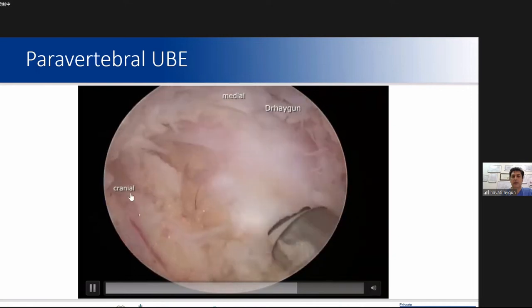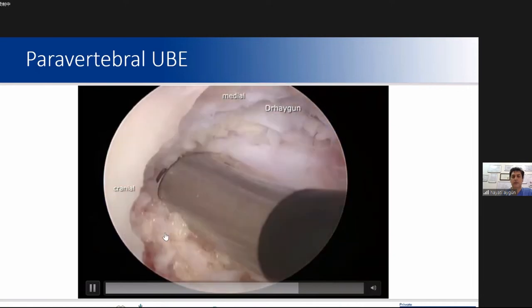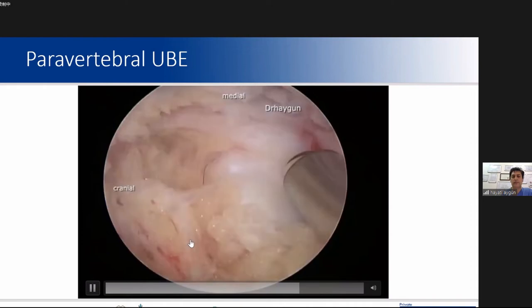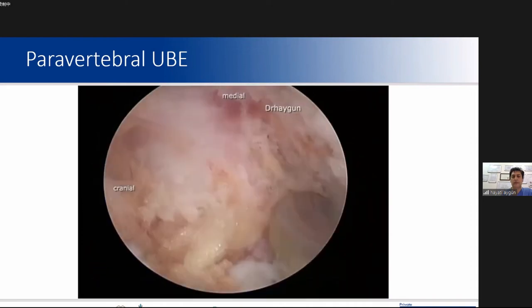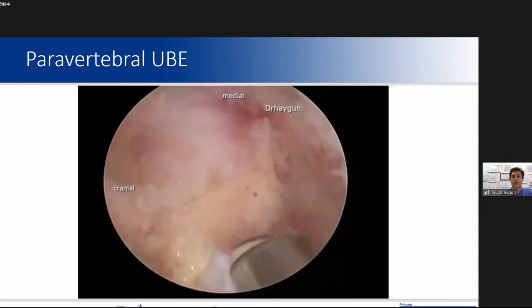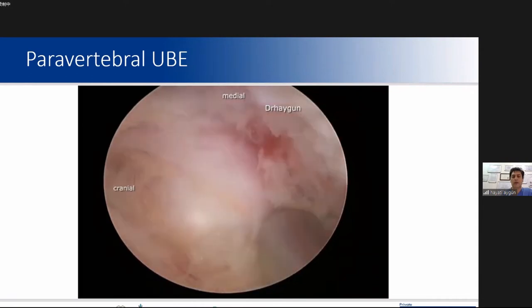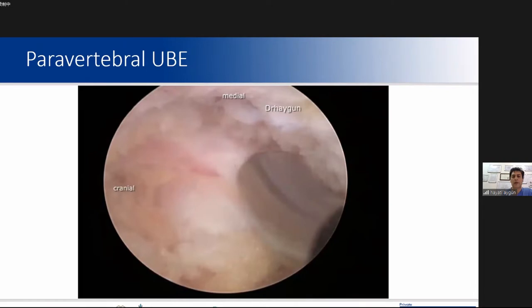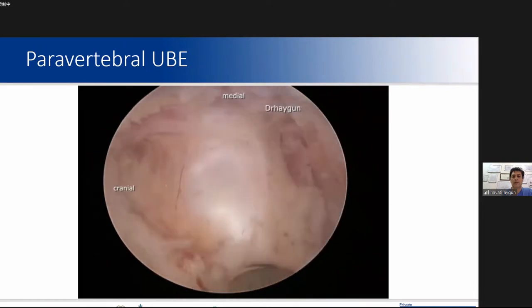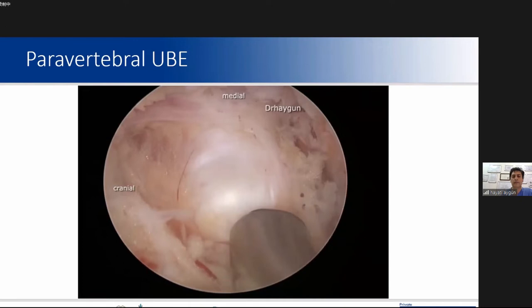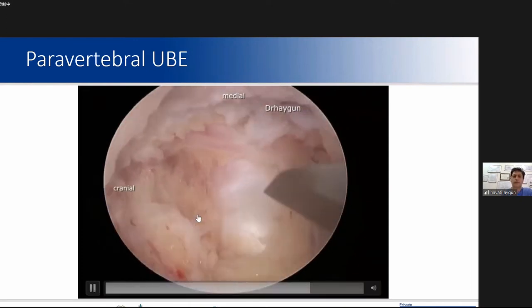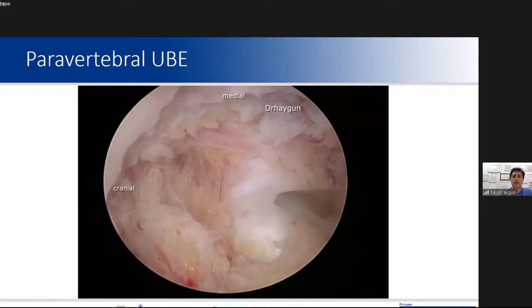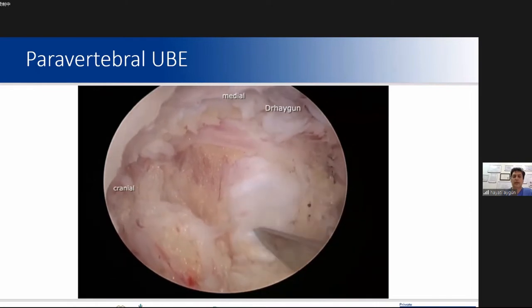This is the disc, and this is the nerve root. The disc is now opening.